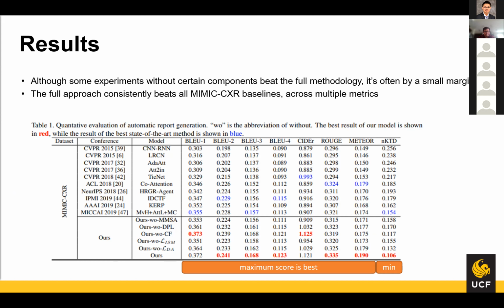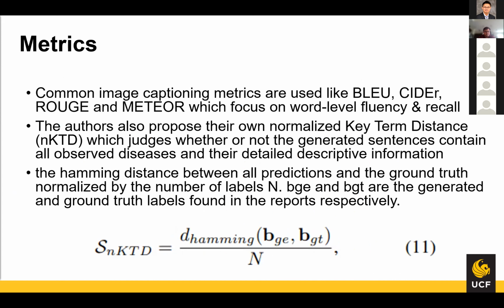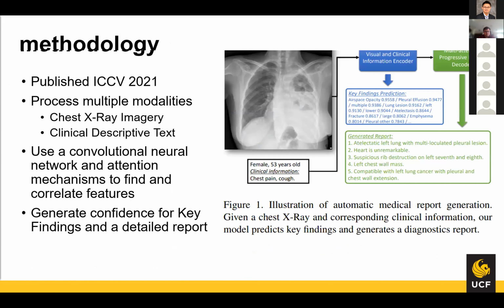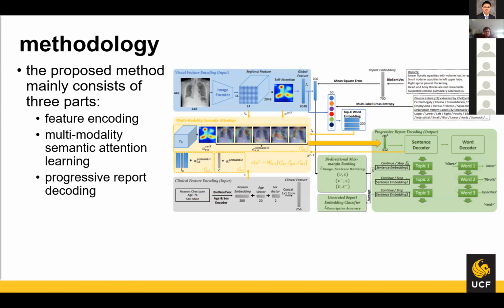Yeah, that again creates some barriers for ready adaptation, right? If there are multiple stages, it's very difficult to train, and a lot of parameters to tune, that's going to be a problem. Most likely, this system will be used by radiologists. They may not have any technical training from computer science, right? So how you expect them to train or use the system is questionable. If it's too complicated, it's not easy to use.